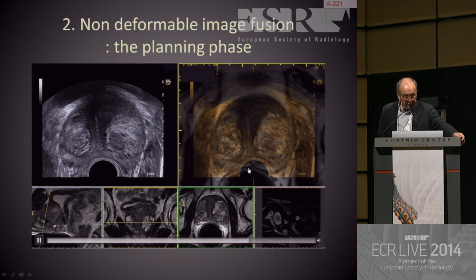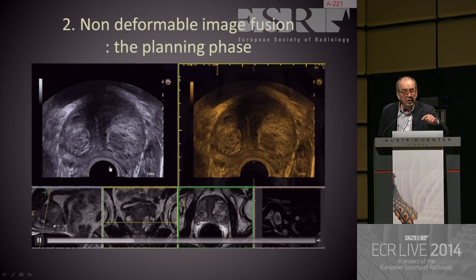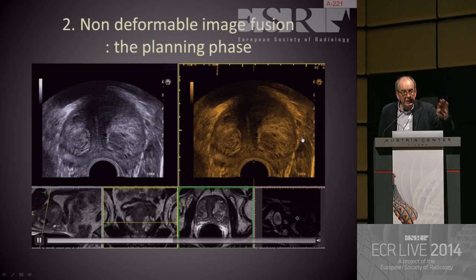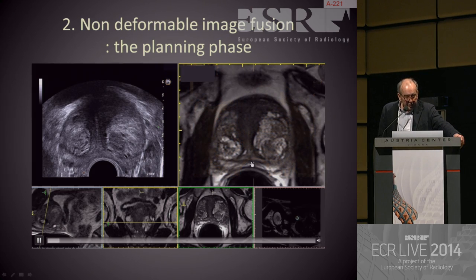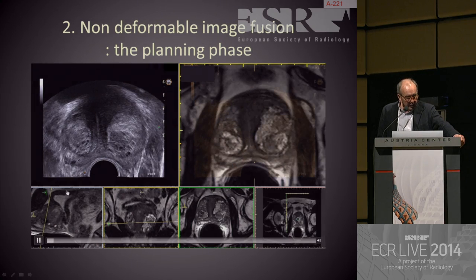consistently, because the deformation of the posterior aspect of the prostate by the TRUS probe is not the deformation of the prostate by the MR probe. And if you don't use any endorectal probe for the MR, the deformation is not there. So you still have an approximate overlay of both organs on both techniques. But well, you can be satisfied.